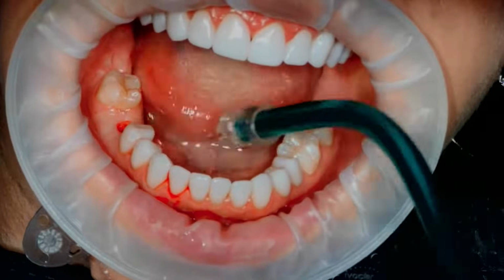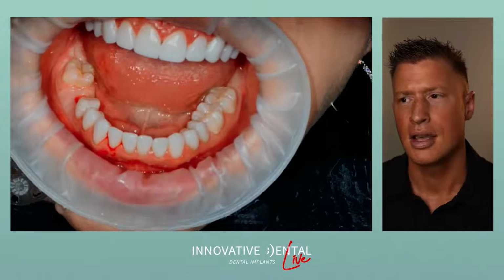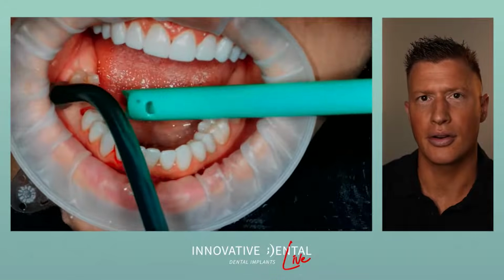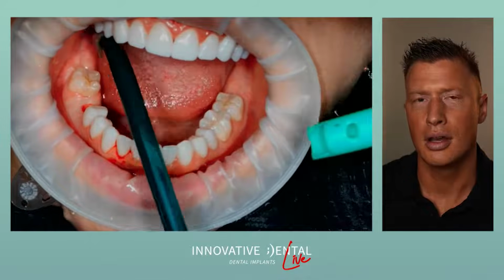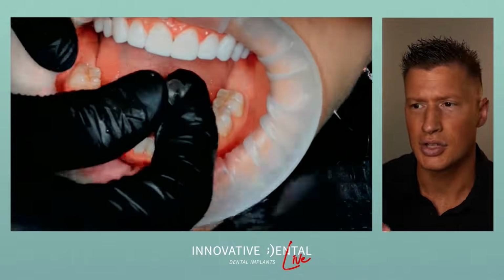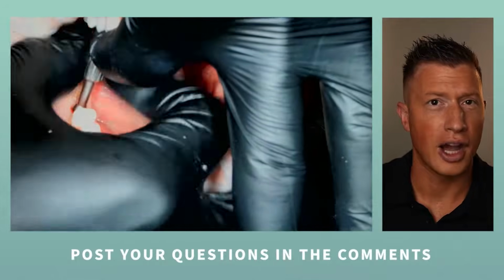And the attachments we use are usually called tie bases or titanium bases. And we're going to attach a porcelain, all e.max material, a super strong porcelain material designed to be bonded to that titanium, and screw that into the implant down the road. But here I am profiling.